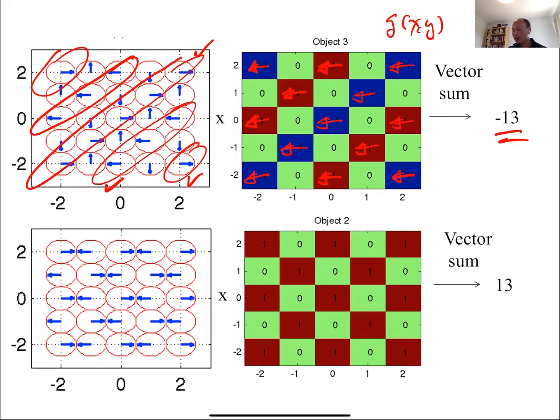Okay, so solely positive objects are a little more realistic, and so it's only ones or zeros. You notice the spatial pattern here is such that there is also diagonal variation. So things are the same along the diagonals.